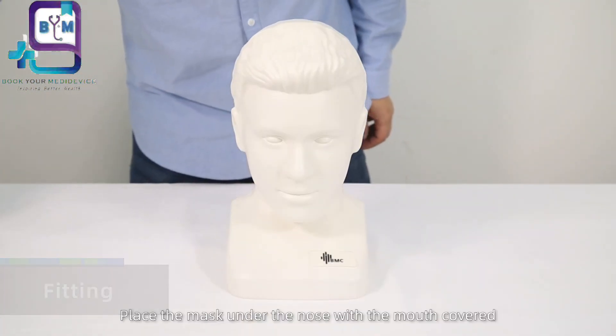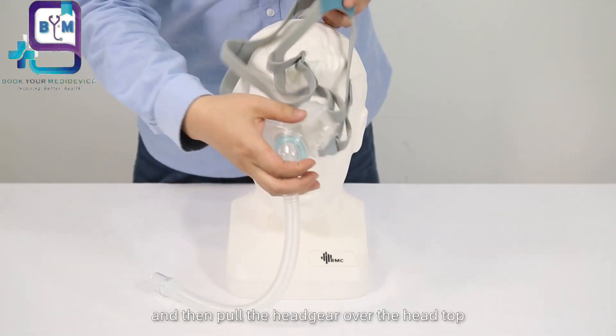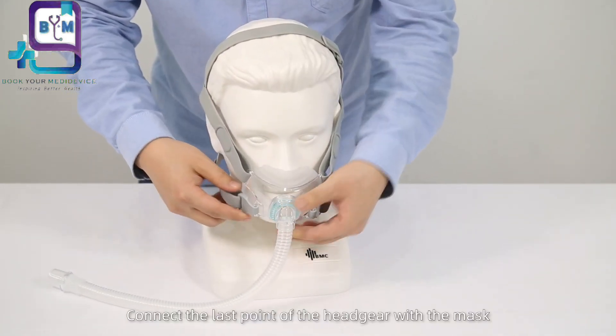Place the mask under the nose with the mouth covered, and then pull the headgear over the head top. Connect the last point of the headgear with the mask.